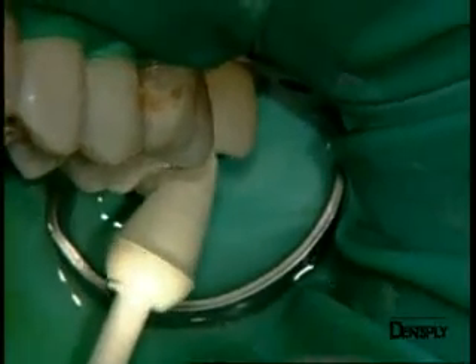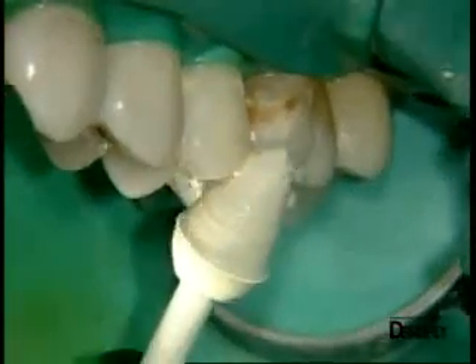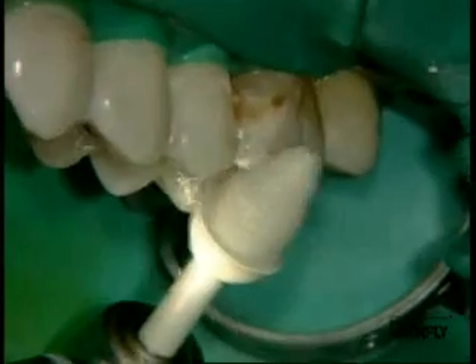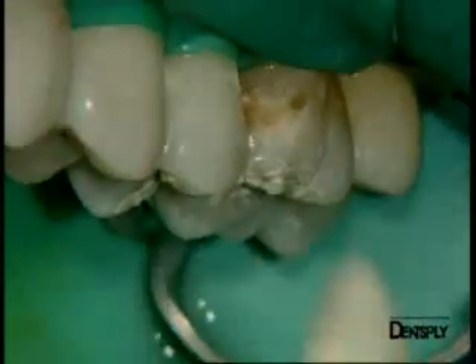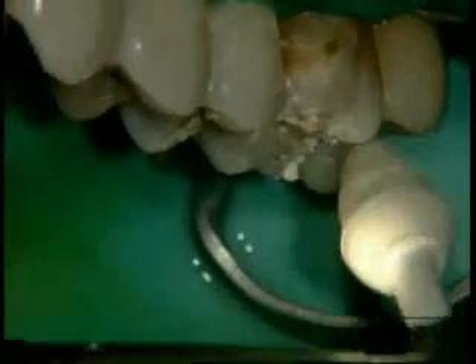A single polishing instrument such as Pogo lets us obtain a good shine on the various fillings. We can now see all the fillings in place, how they fit, and the excellent quality of the anatomic reconstruction.